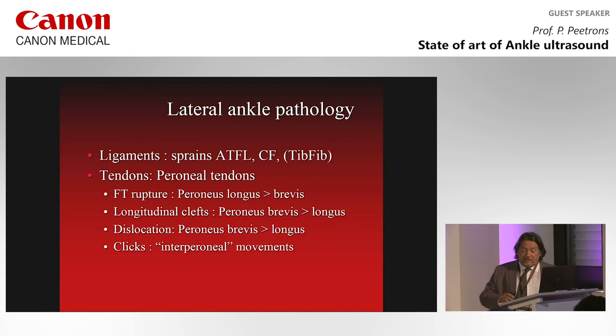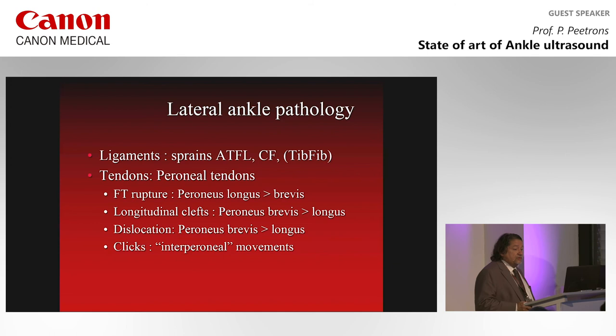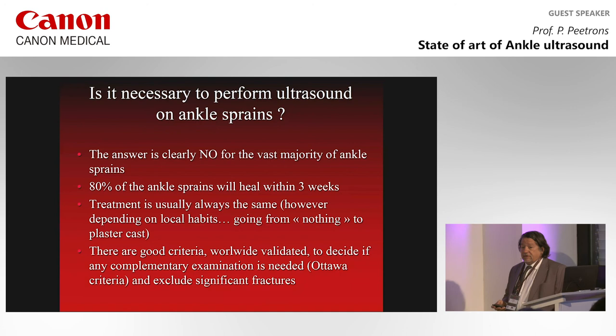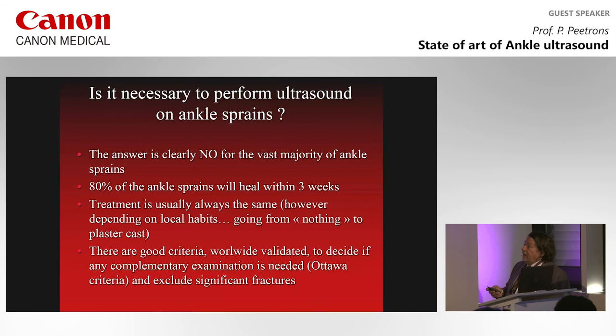But first of all, the main question that radiologists have in their clinics is, do we need to do ultrasound in ankle sprain? So this is very important to know that the answer is clearly no, because the vast majority of the ankle sprains will heal completely without any treatment, or with a light treatment like some crutches or even nothing. 80% of the ankle sprain will heal without any problem within 3 weeks. So the treatment is usually always the same, but depending on your local habits, going from nothing to a plaster cast.